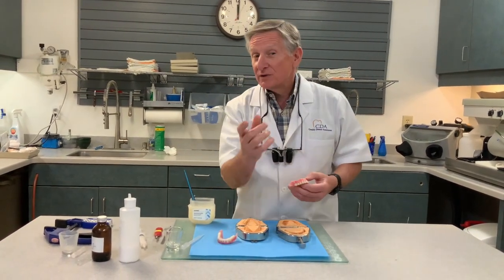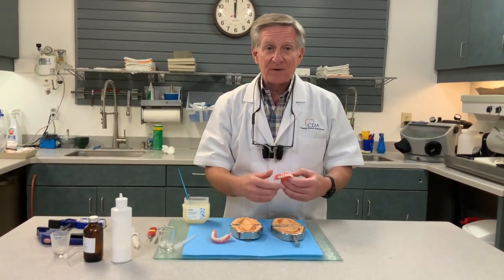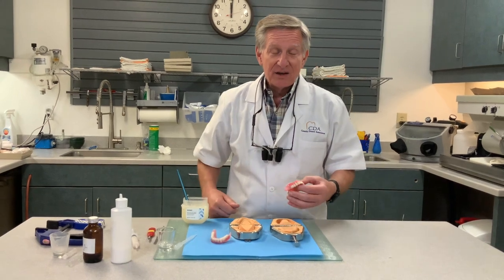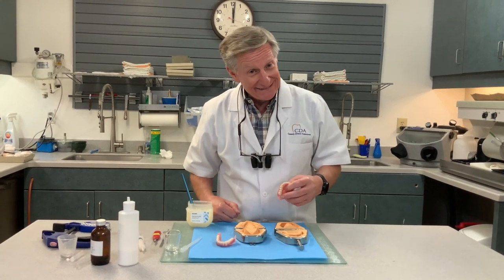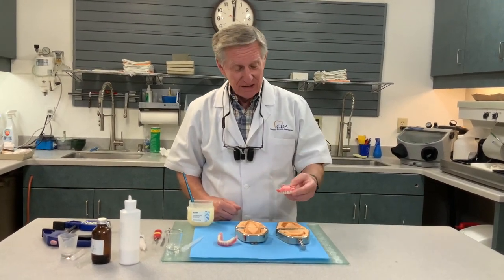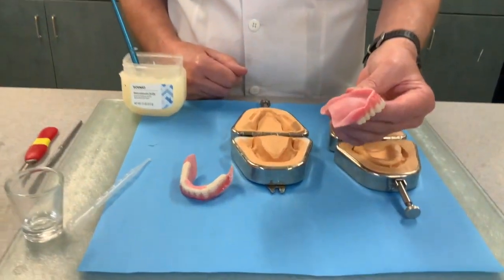Dr. Turbyfield used to say that if they haven't paid their bill yet, give them their old denture back — they'll call you in 24 hours and say they can't wear it. We don't do that. So let me show you how to put the flow cast into the duplicate dentures.